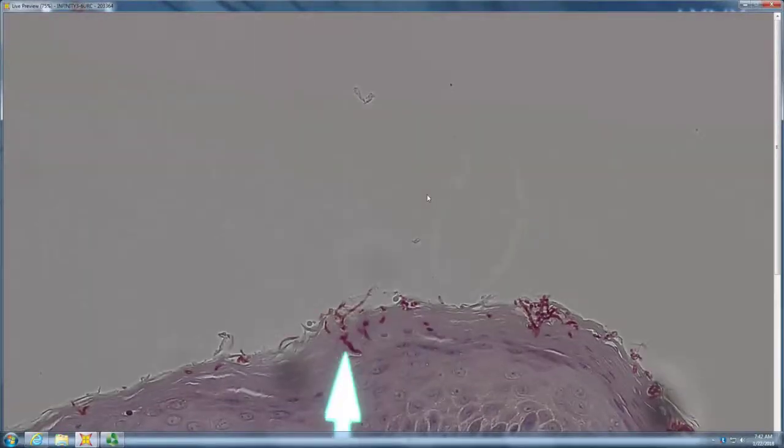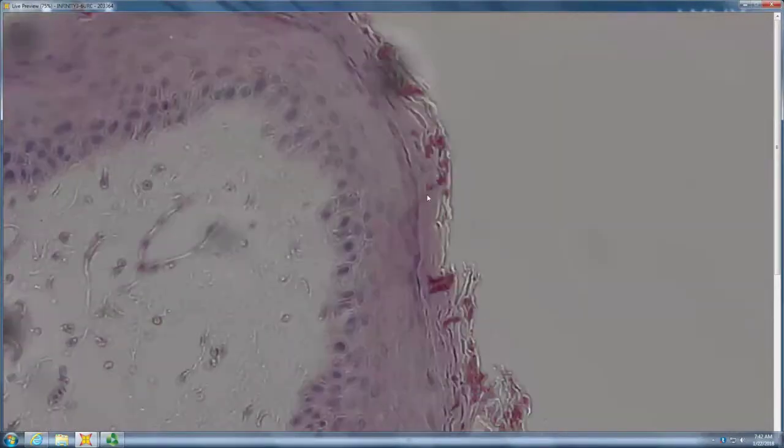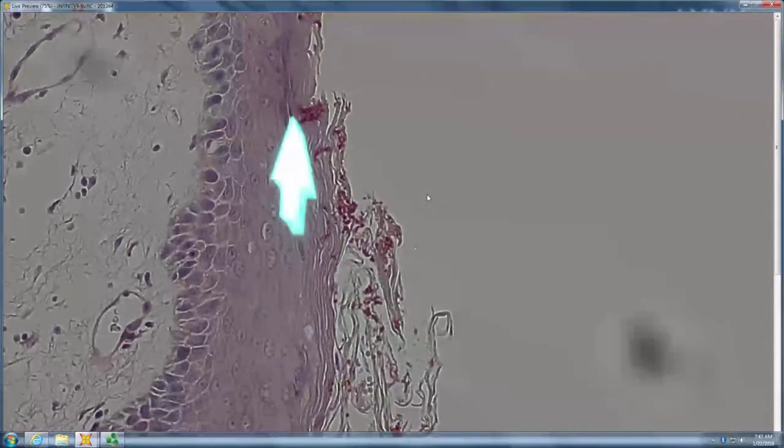Looks like maybe a mucosal site. And what direction are the hyphae going? North south. So more likely Candida, especially when you have little yeast as well as germ tubes in there. Tinea swims, Candida dives.